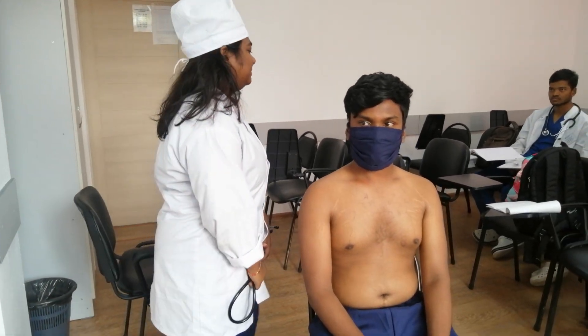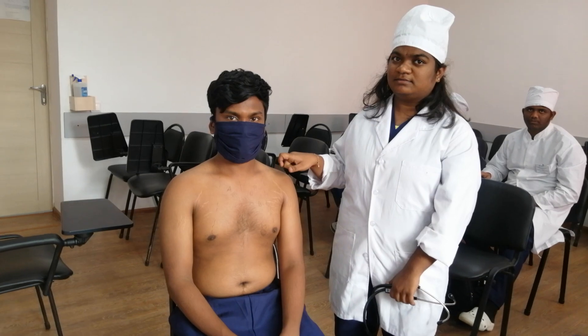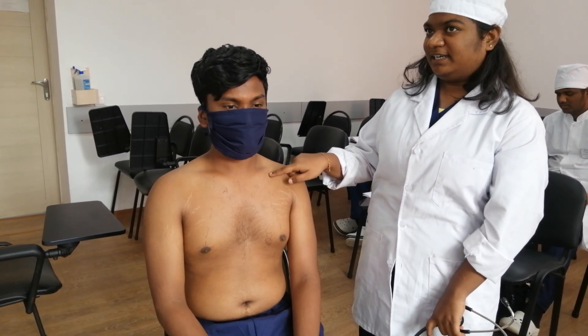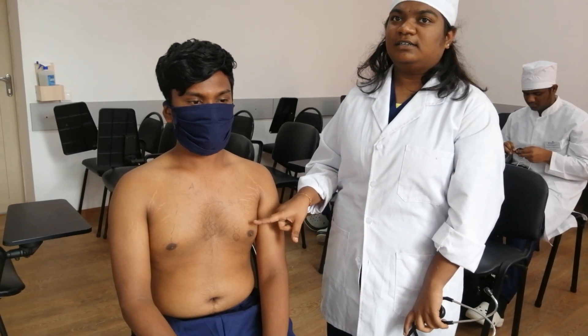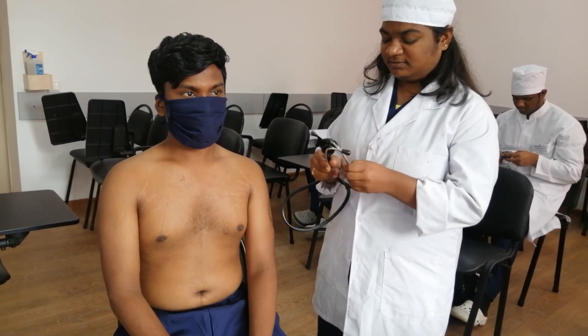Please perform auscultation of the heart. Start with the first point: the mitral valve point. It is located at the mid-clavicular line in the fifth intercostal space, 1.5 centimeters inside. Place your stethoscope membrane and check which side is working.